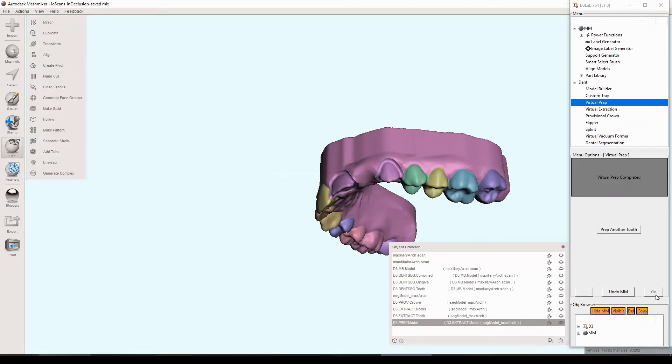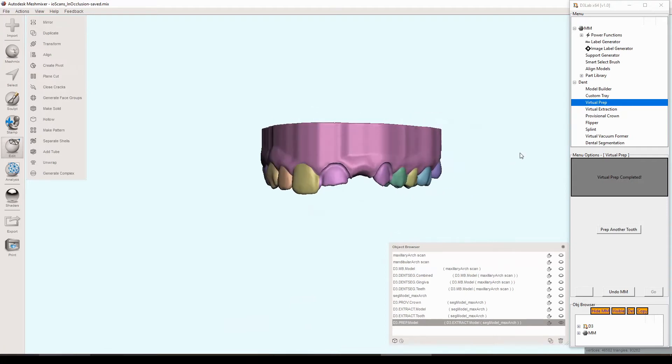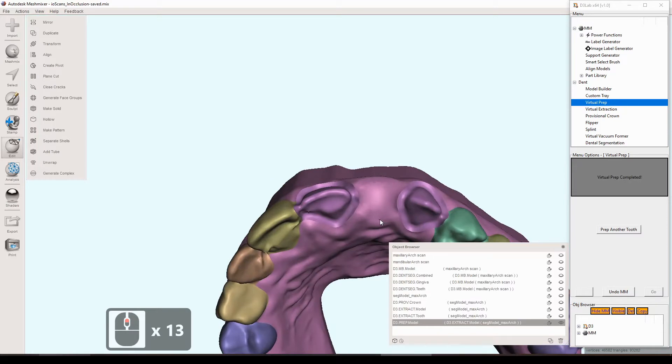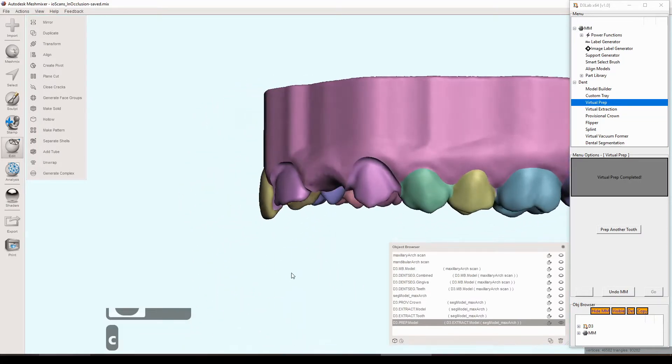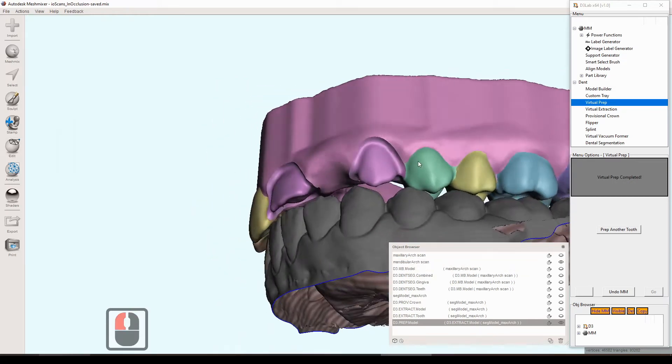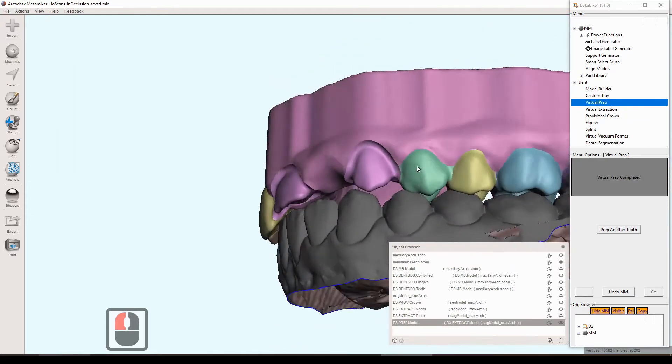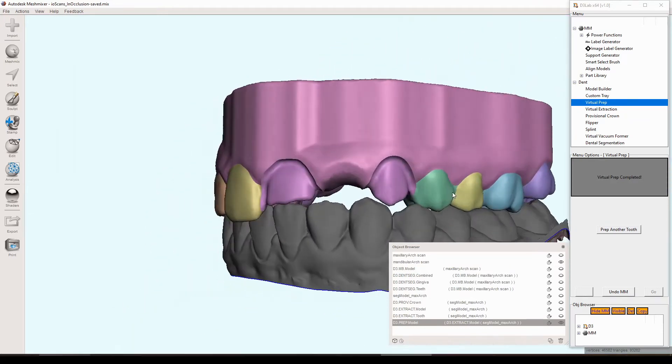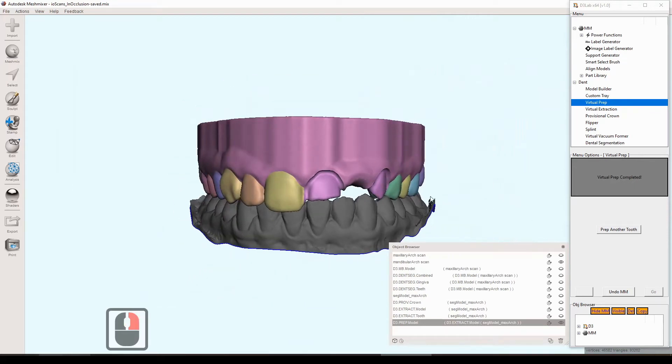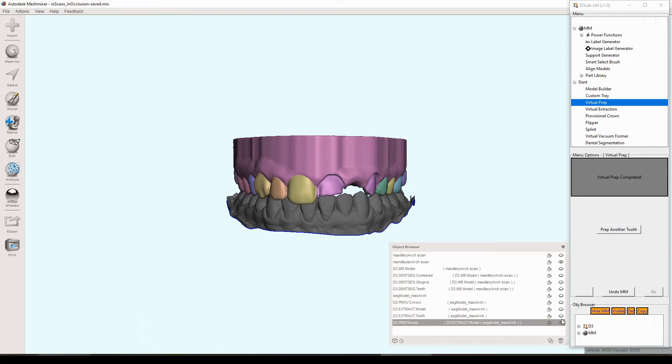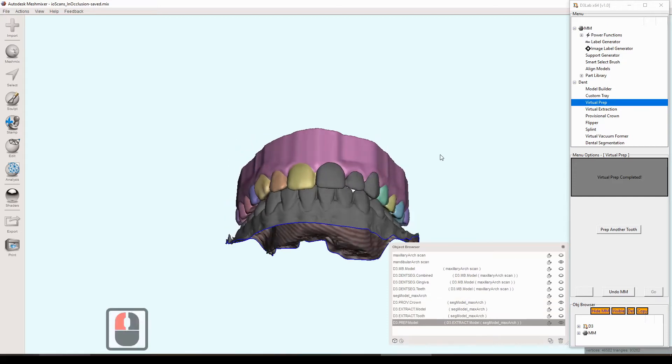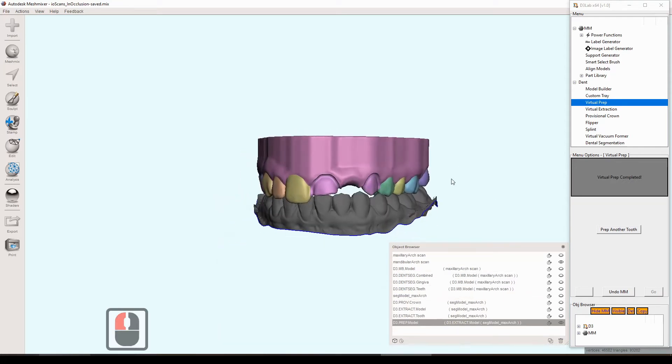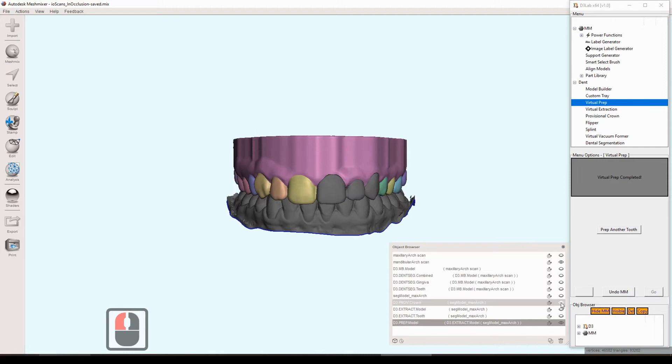And then there is your virtually prepped model. And again, it doesn't take into consideration anything like undercuts or anything like that. So it's not like an ideal prep by any means. But it's definitely 100% one millimeter offset shell of the original input scan. So it's just a one millimeter reduction all the way around. Does not take into consideration undercuts. And then that's kind of just showing the reduction in comparison to the lower arch. So it's about one millimeter in the right places. Sometimes in the incisal area, if it's one millimeter in both the lingual incisal and facial, all those things combined can make a little bit more than the one millimeter. So it could be more than that incisally.